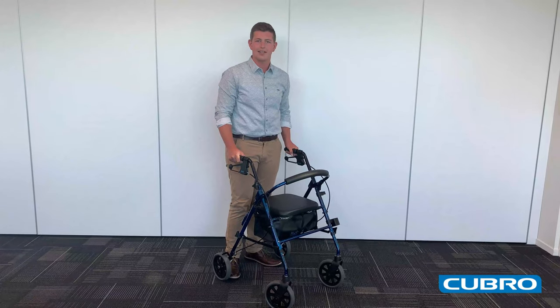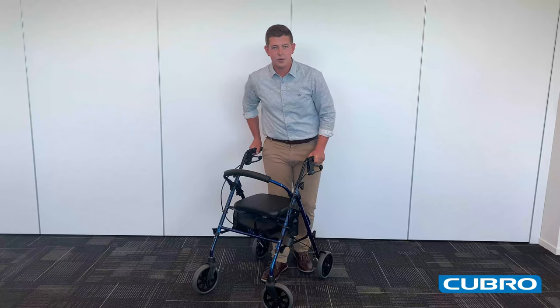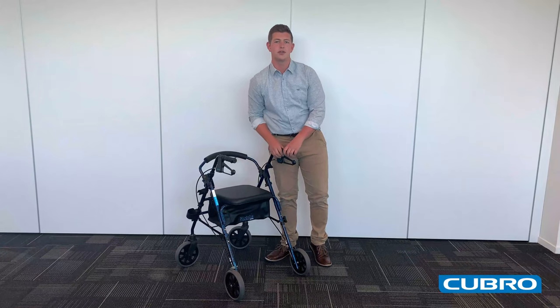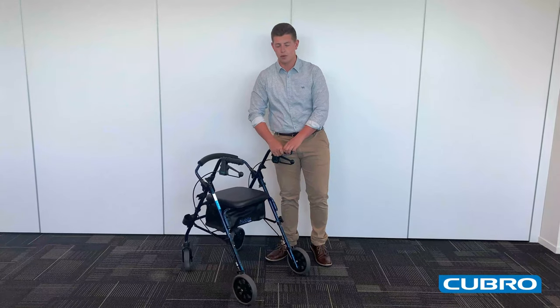Now we move on to the Mobilist Plus walking frame. This has quite a few more features. One of the main ones is the height adjustment that we can get in the wheels. This means that we can adjust the floor to seat height to suit your end users' needs, to make it easier for transferring on and off the walking frame.